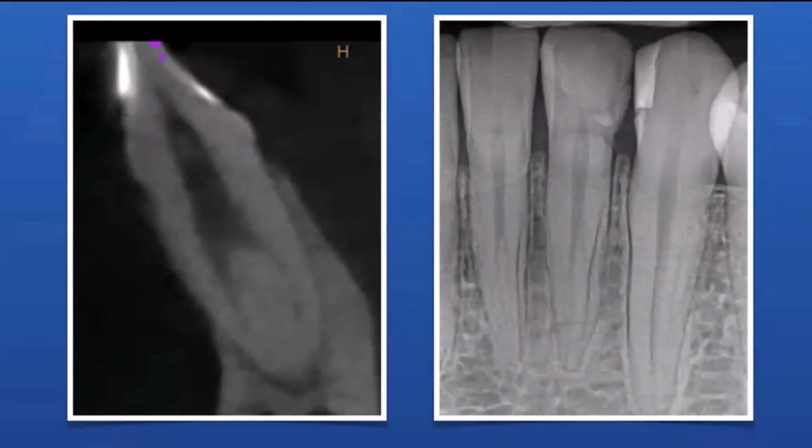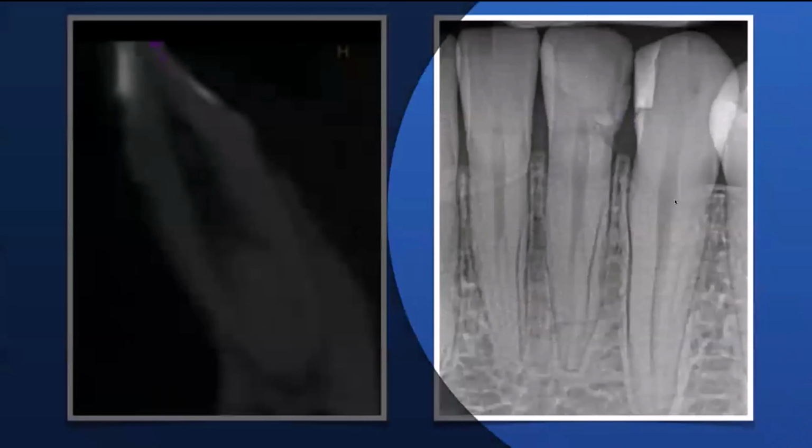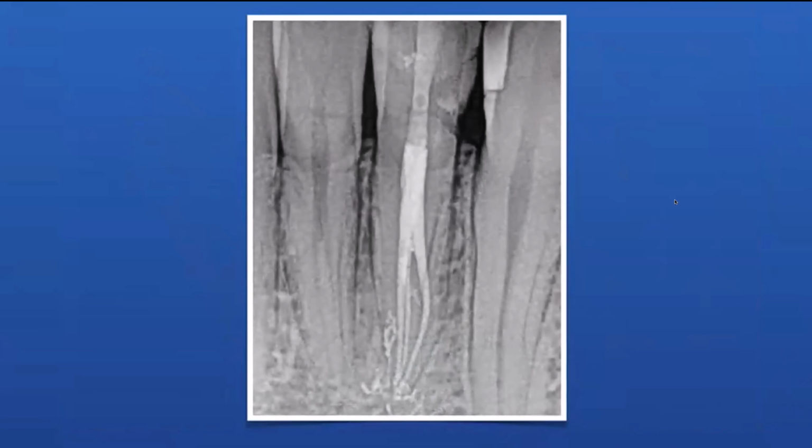Just a couple of examples. This is a lower incisor. We know there are two canals here. We can see the two canals there, right? I found two canals. I instrumented two canals. This is the final result. Pretty clean case. But on an off angle, that fluid dynamics was able to pick up a third branch completely separate. There's no cone there. That's all bioceramic sealer.